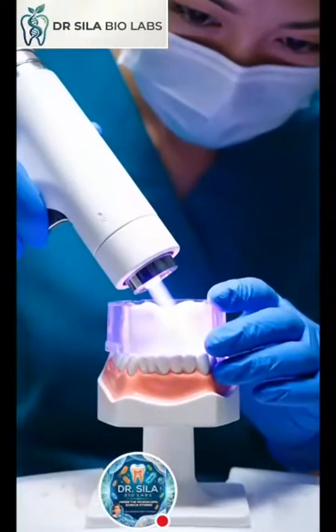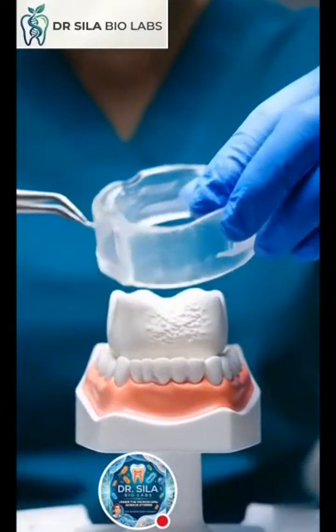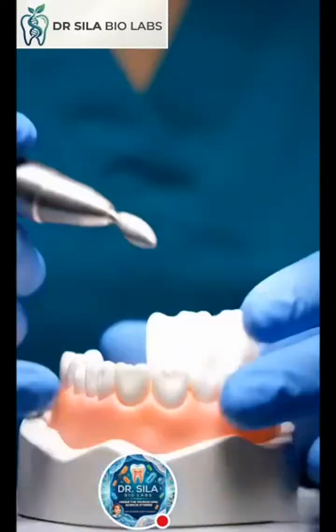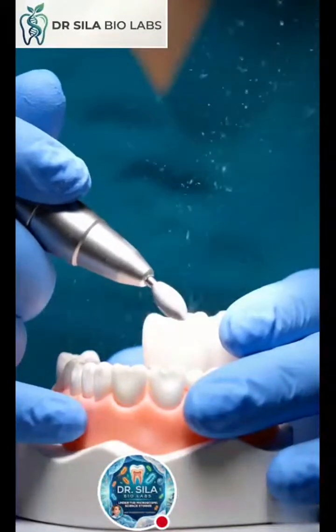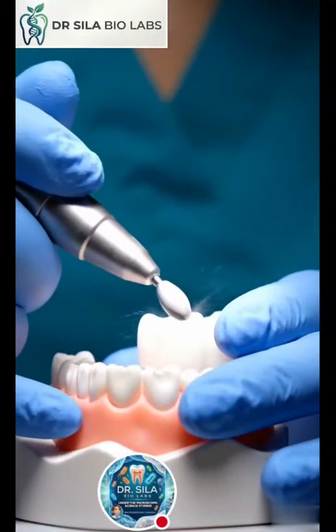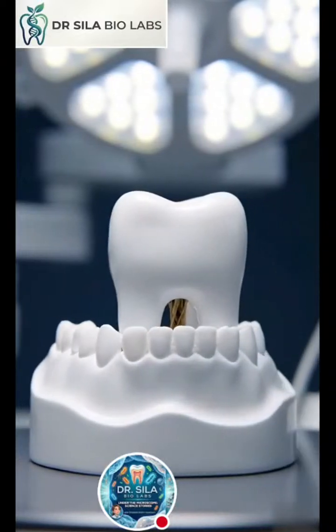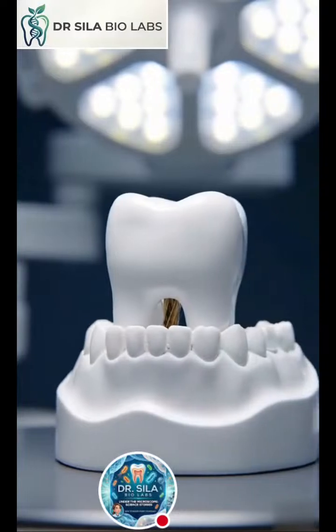the physical tooth. Once cured, the matrix mold is removed. The dentist uses fine shaping and polishing, turning it into a neat stub that is perfectly prepped and ready to receive a custom prosthetic dental crown.